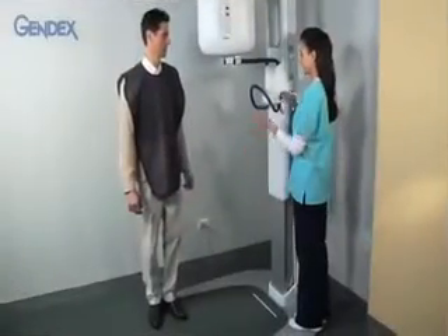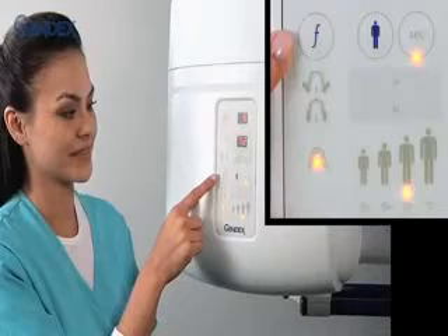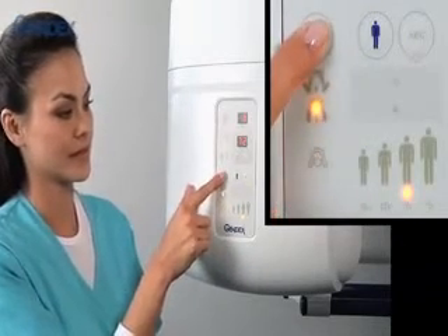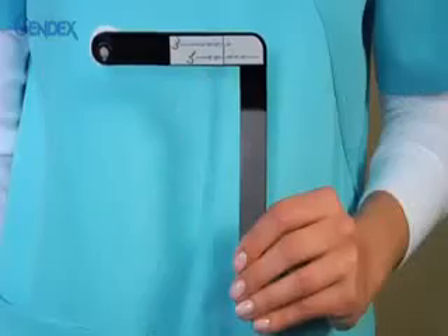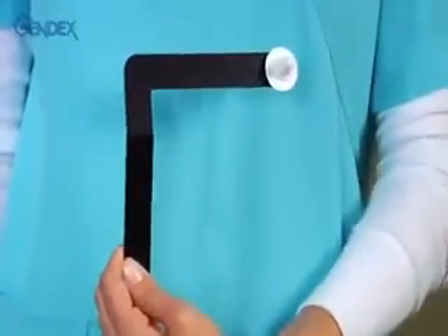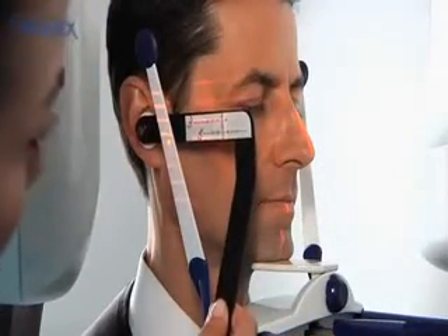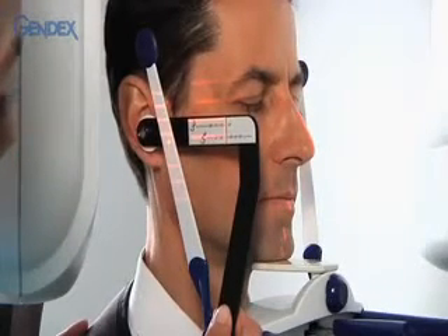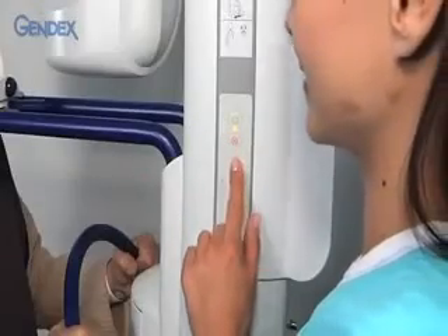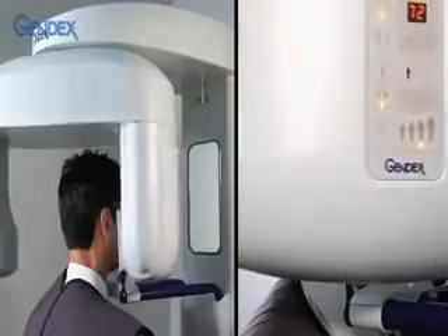TMJ projections. Patients are positioned and removed from the unit using the previous instructions. For lateral TMJ exposures, push the function button to highlight the lateral TMJ choice. Both TMJ projections utilize the flat chin rest. This is the TMJ ruler with a disposable ear covering in place. With laser lights on and the patient's eyes closed, insert the earpiece of the ruler into the patient's ear and match it to the horizontal laser lines. Manually move the patient to line up the lateral laser line with the vertical line on the ruler. Clear the area and trigger the exposure. Repeat exposure with open mouth position as needed.